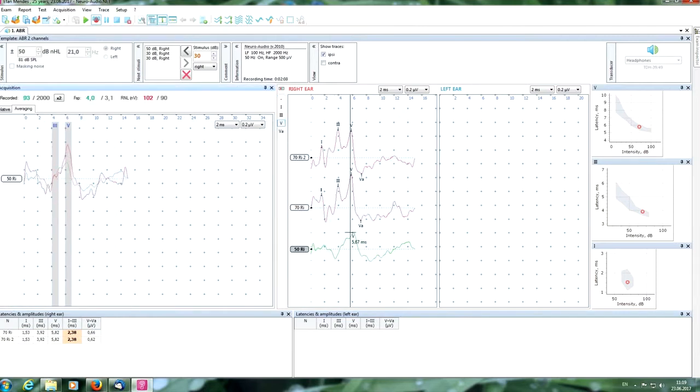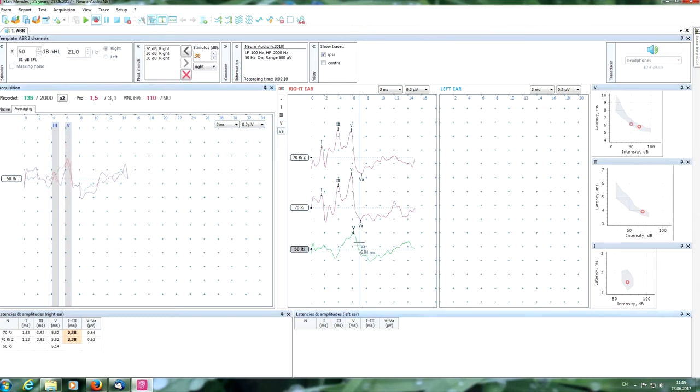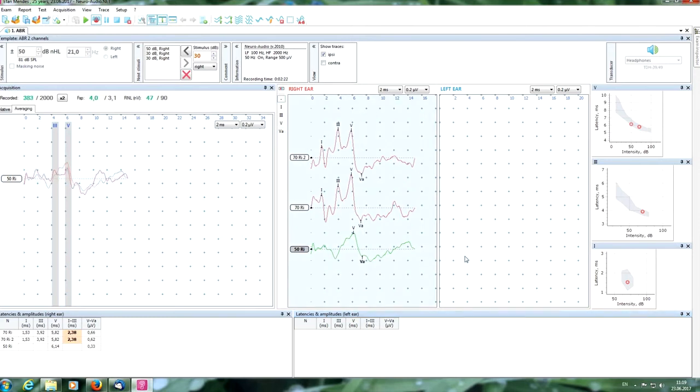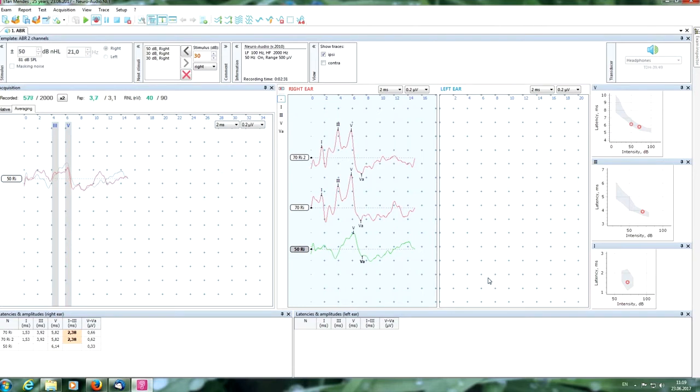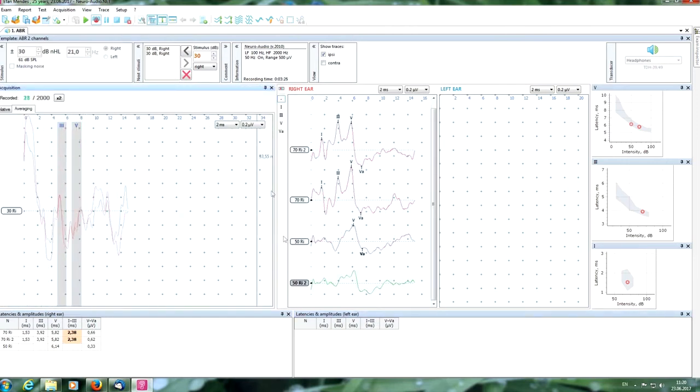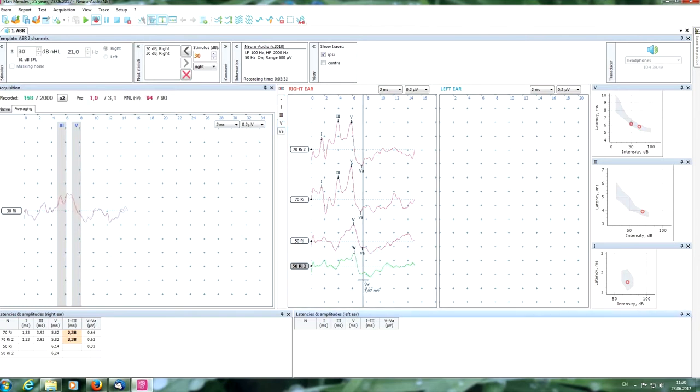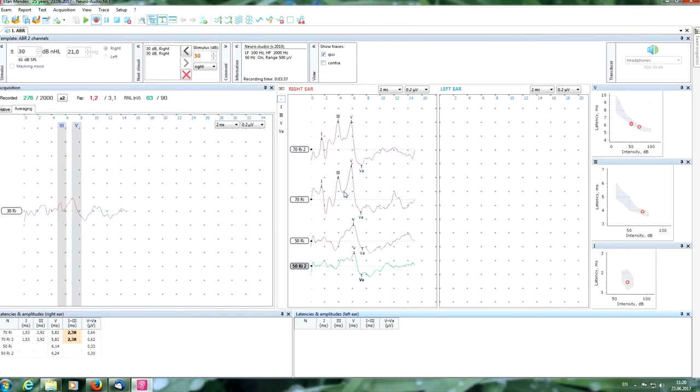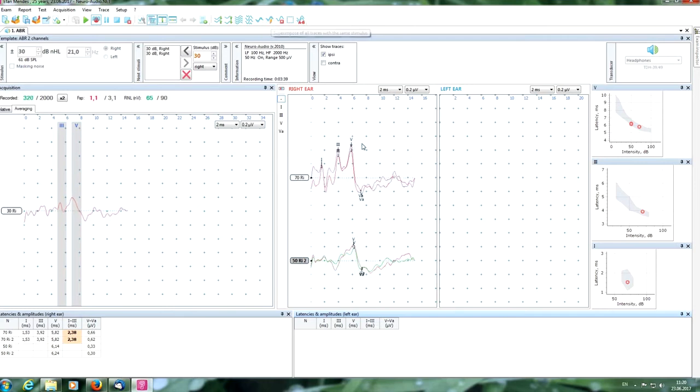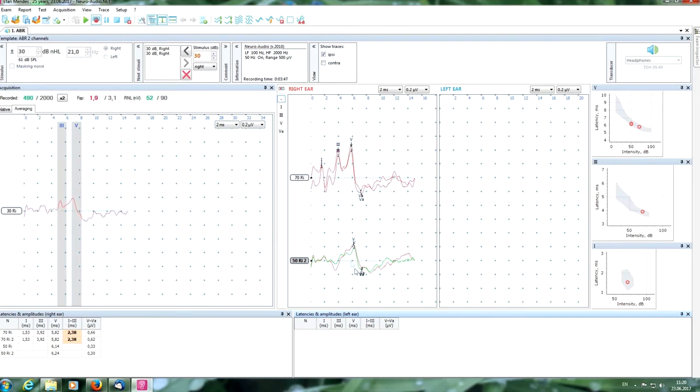We will put a marker of the fifth wave and can see a new point here. It is normal latency. Now we are getting the second cycle response. Put the markers again. As you can see, when we decrease the intensity our latencies of the main peak become longer and the amplitude become smaller. It is normal.